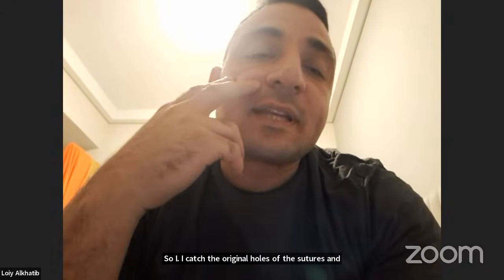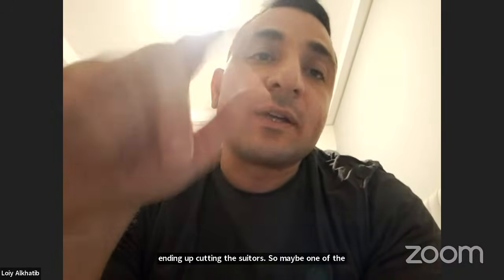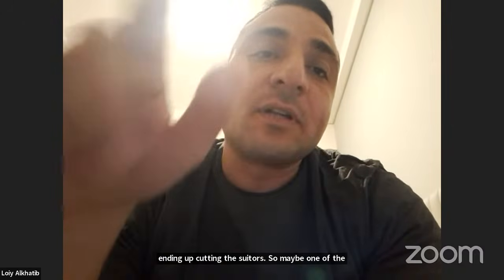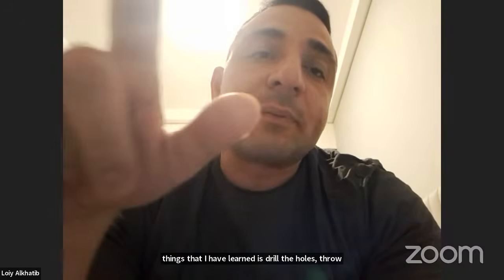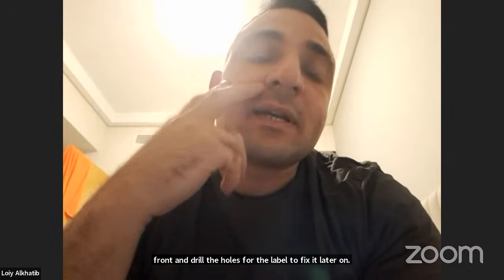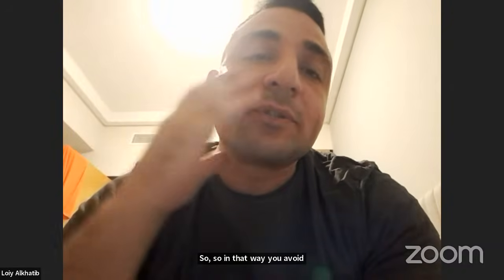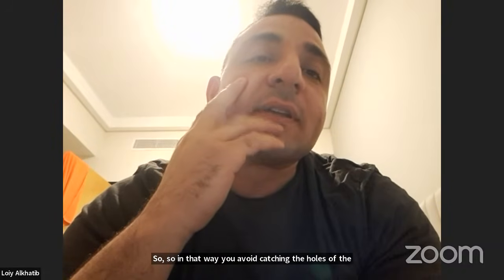So maybe one of the things that I have learned is to drill all the holes together. So drill the holes from back to front and drill the holes for the labrum to fix it later on. So in that way you avoid catching the holes of the original sutures. Do you agree with that?